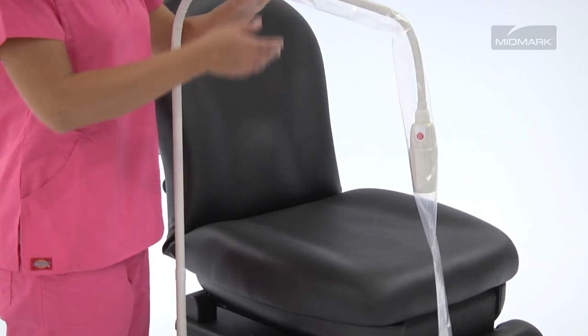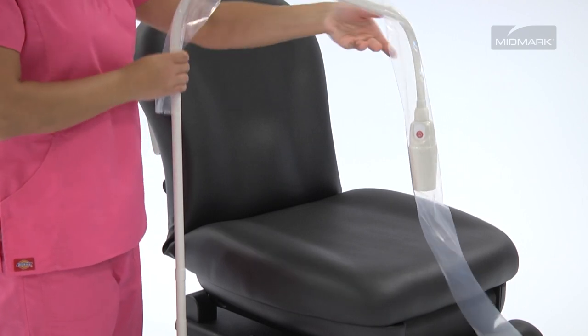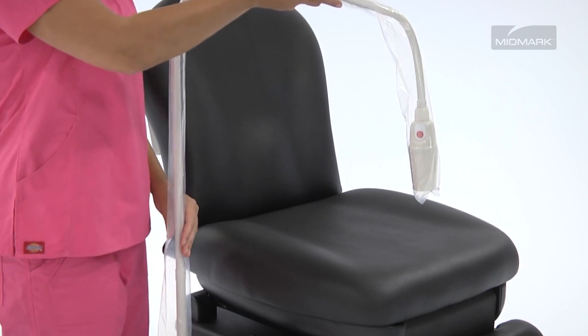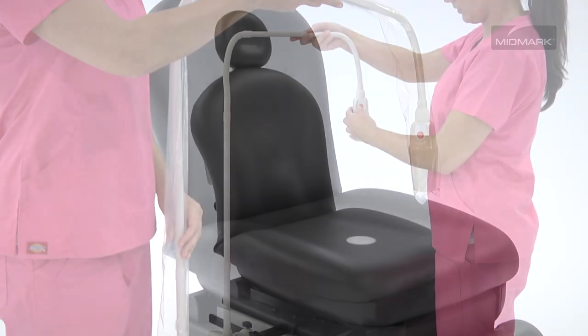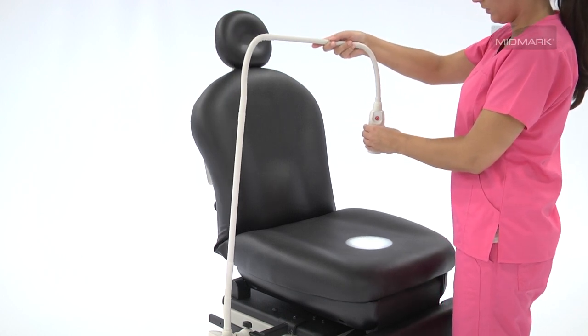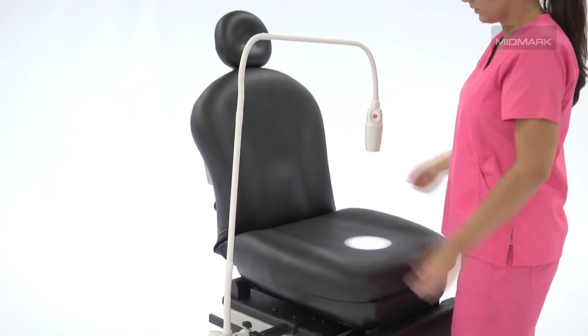Optional disposable slip-on sheaths can be applied and are designed to allow you to maintain an aseptic environment during procedures and to aid in protecting your light from contamination. The Flexarm is designed to be easy to position and stay in place without drifting, allowing you to position the light precisely where you need it during procedures.